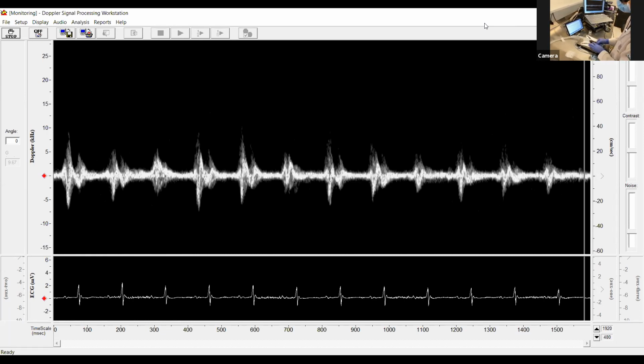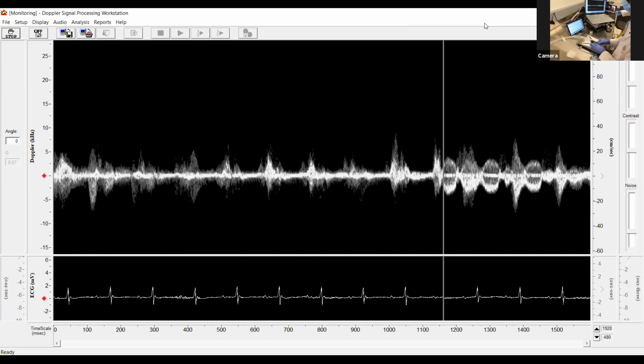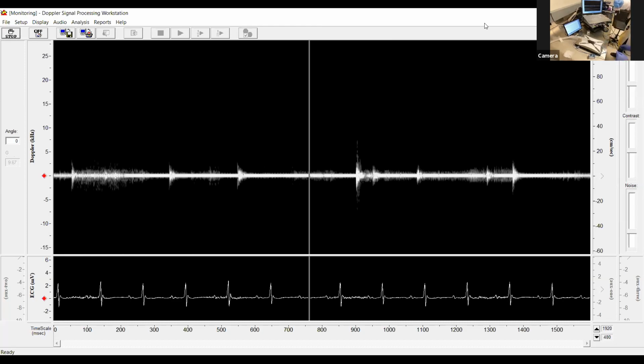Okay, so I'm going to give Sydney a quick hand. So just bear with me as I get my microphone pulled over. Perfect. You're connected.